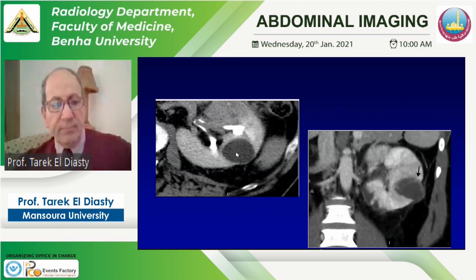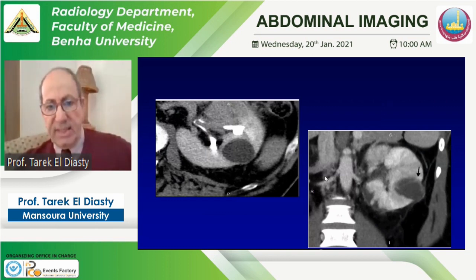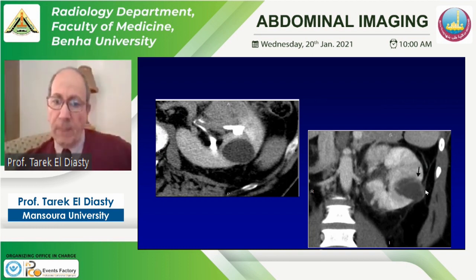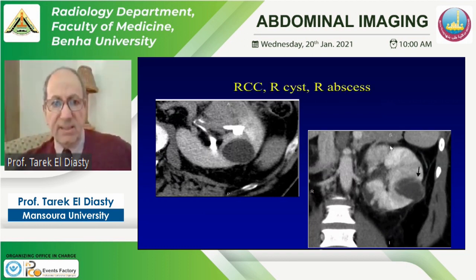This example demonstrates the value of post-contrast delayed phase imaging. An anteriorly enhancing lesion in the anterior cortex — renal cell carcinoma — alongside non-enhancing renal cysts. In another patient, there is a minimally enhancing lesion with peripheral enhancement and thickening of the renal fascia — consistent with a renal abscess. These show different enhancement characteristics for renal cell carcinoma, renal cysts, and renal abscess.